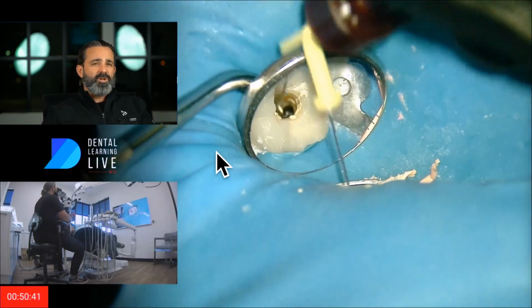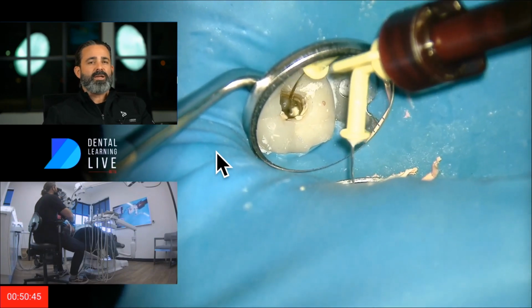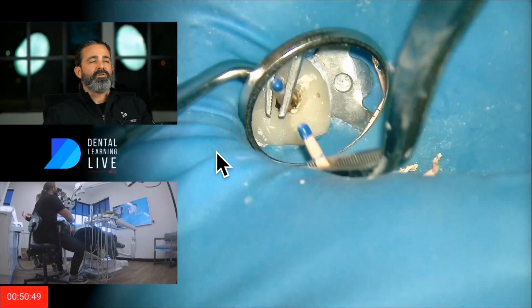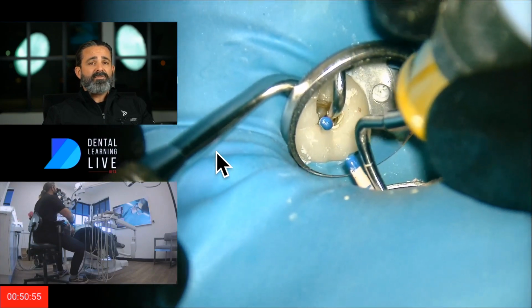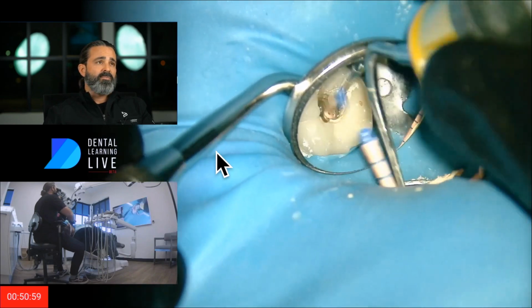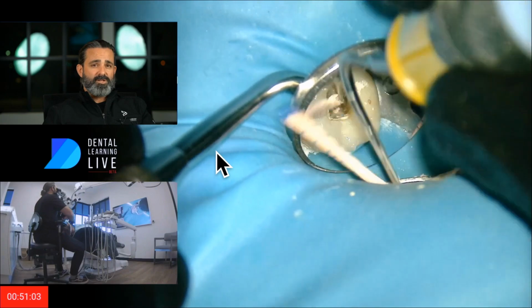I'm doing more of a true continuous wave where I am applying heat and down pack. And at times, those are some of the scenarios where I'll favor epoxy-based sealers, actually, because I don't like activating these bioceramics with heat going down deep. I haven't been a fan of the way the obturation feels, performs, and looks in my hands.